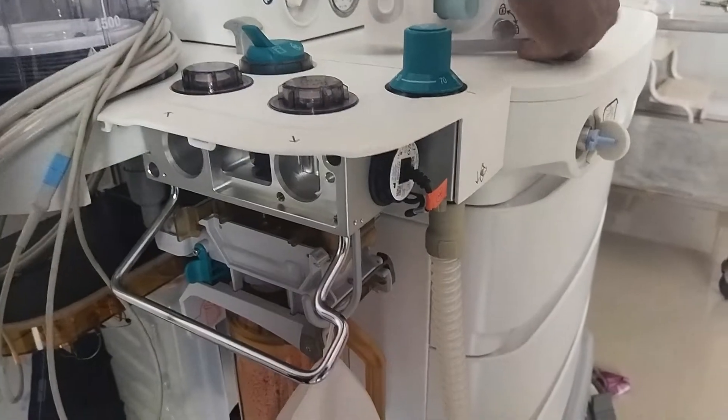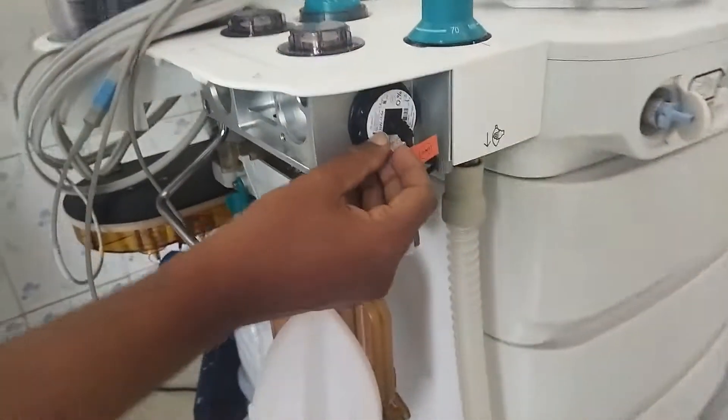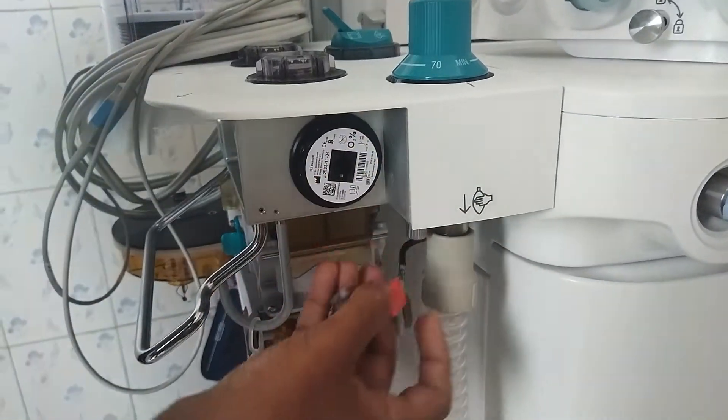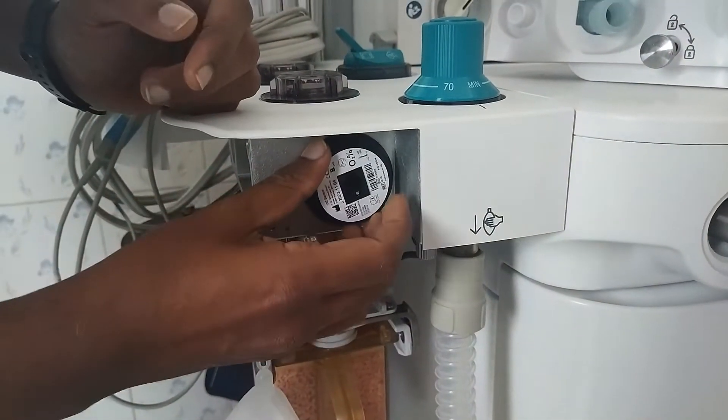You can keep it in. Here you have the O2 sensor — just take the cable first, then remove the O2 sensor.